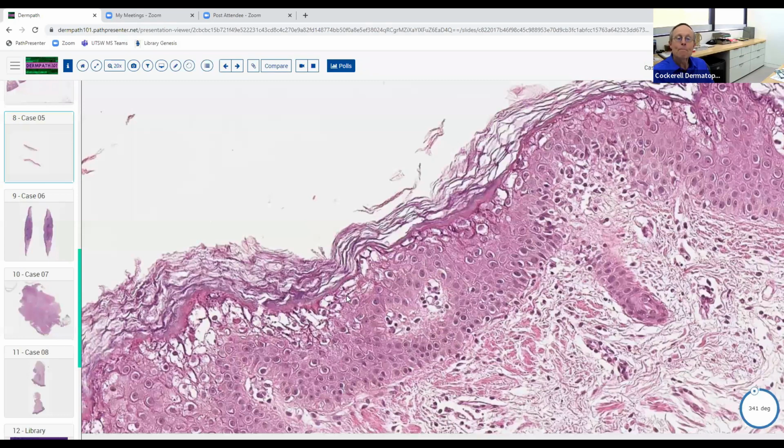epidermolysis here. And what kind of cornified layer changes are we seeing here? Is that normal or is it thickened? It's definitely thickened. So what's this reaction called then? So I was thinking it looked like compact hyperkeratosis in some areas, and orthokeratosis in others.